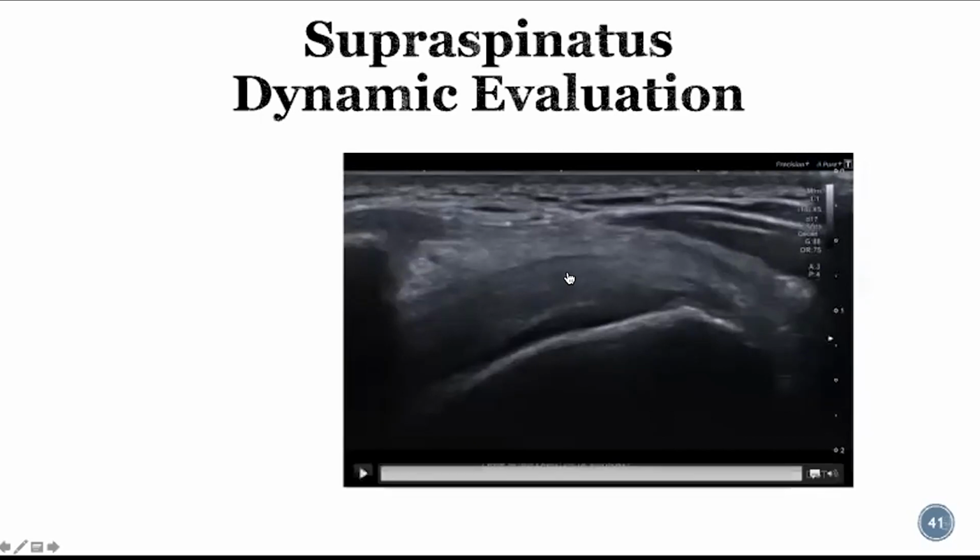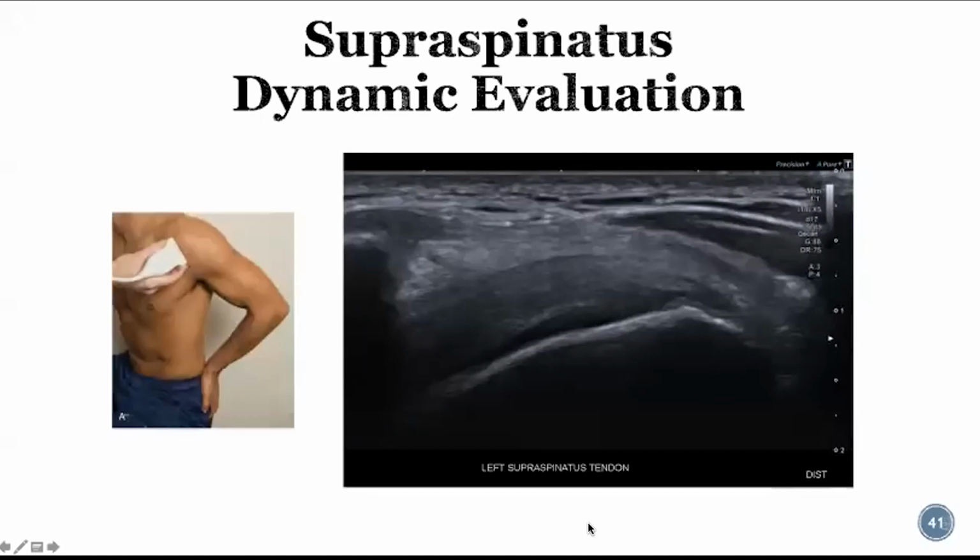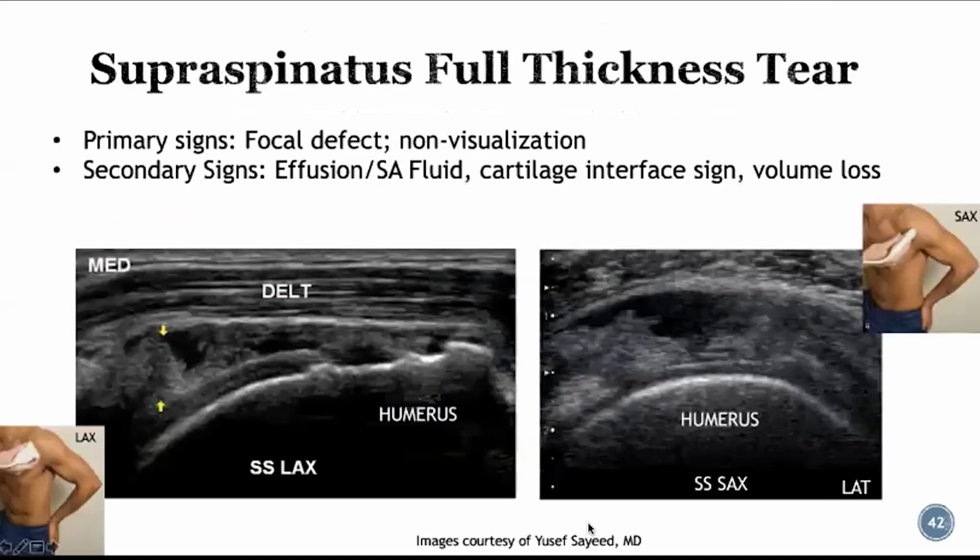And the one thing that I didn't mention on the earlier slides is that the contour of the facets on the greater tuberosity can help you decide what part of the supraspinatus you're looking at. So here, when the facet is flat, you're likely over the middle facet, versus when this facet has a little bit more of a hump to it, you're over the superior portion. You can see that a little bit better in some other views. I don't know if I have any great ones that really delineate those two, but that's a piece of information that can help you determine where you're at.